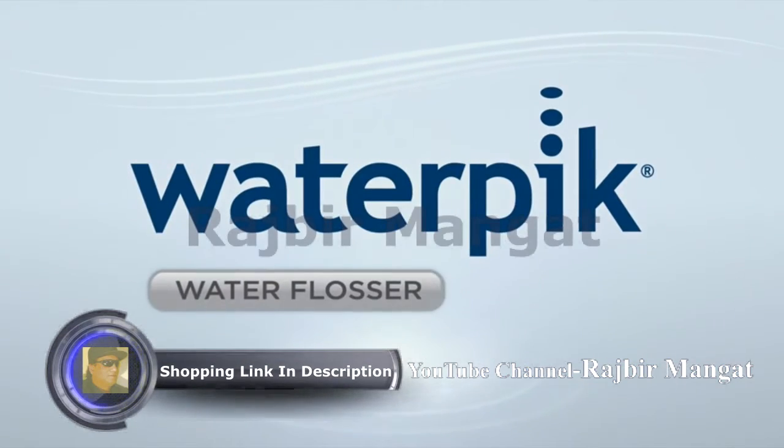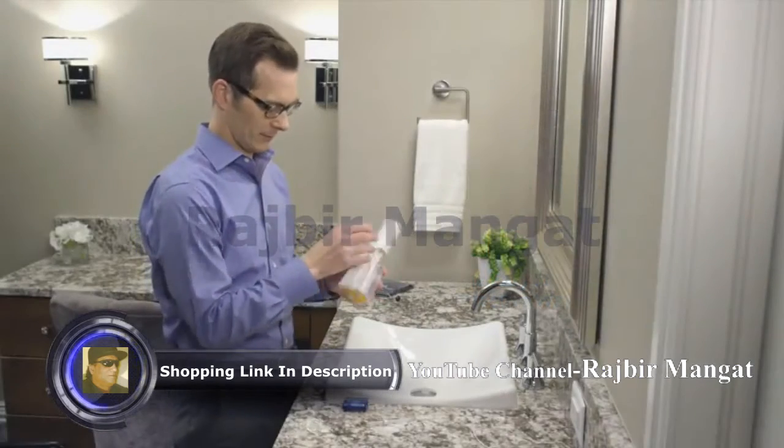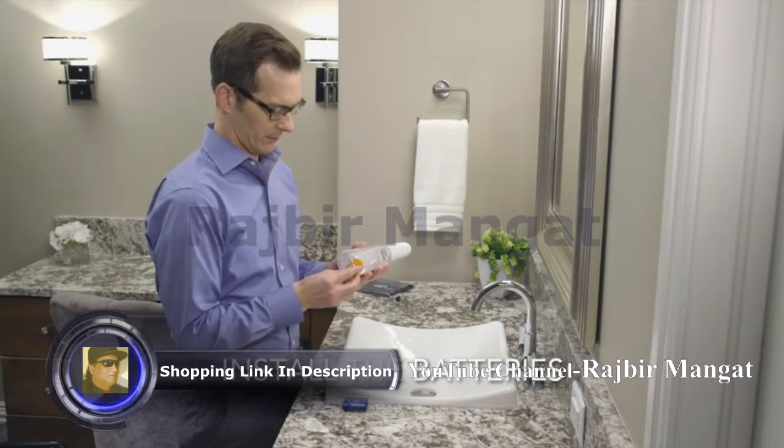The Waterpik Water Flosser is the easy and more effective way to floss. Before using your new Cordless Freedom, you will need to install the batteries.